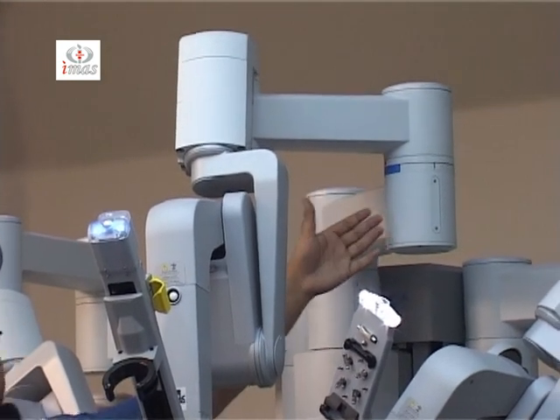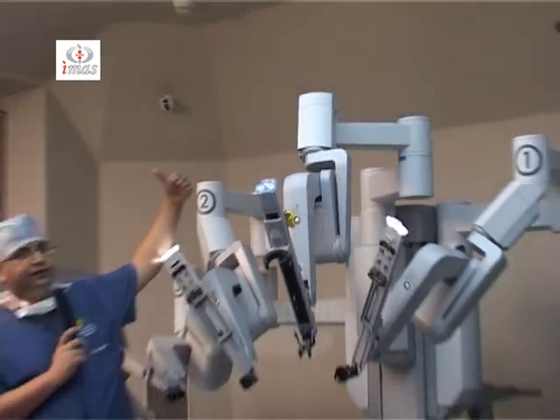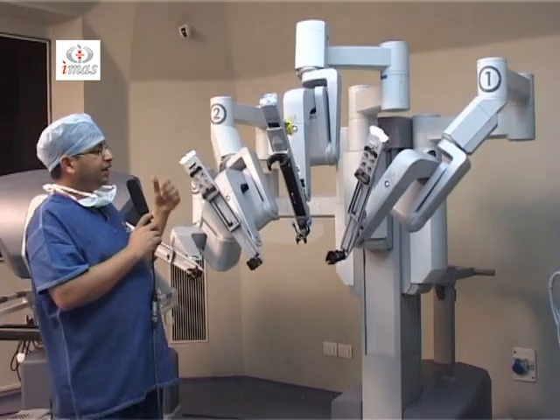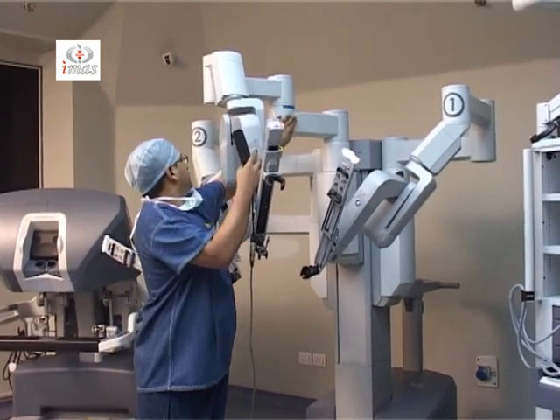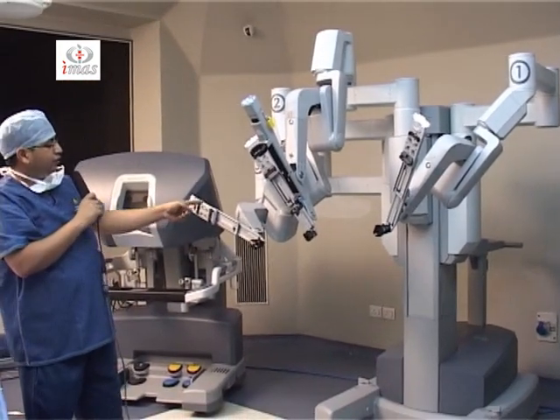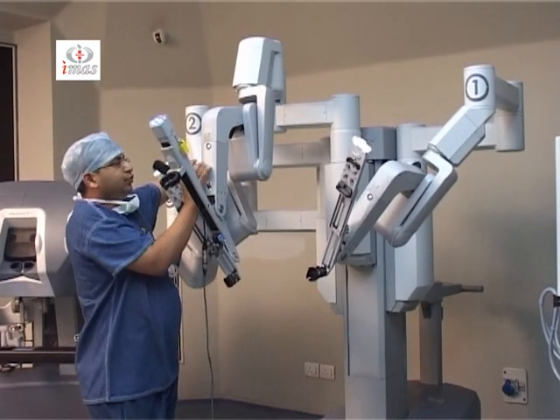This particular setup joint, which contains the sweet spot, if the instrument arm 3 is being used on the right side of the cart, the setup joint faces the left side of the cart. But if the third arm is being used on the left side, this setup joint should move to the right side, as I'll show you now. Like this. If the third arm is on the left side, the setup joint should move like this. But because our third arm is on the right side, we'll move it back using the port clutch button.